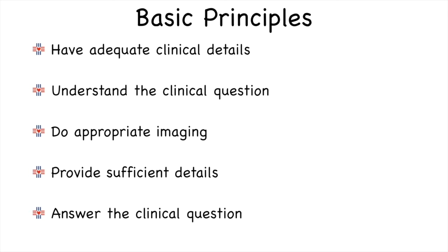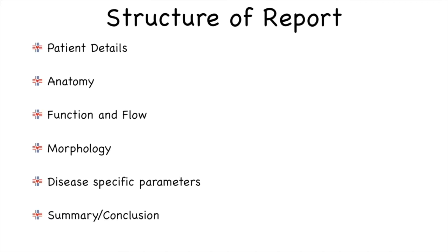The imaging should be tailored for that specific clinical question and the specific clinical scenario, and the report should provide sufficient details to the clinicians so they can take appropriate decisions relating to patient's therapy. It is very, very important that your report answers the clinical question that was asked to you.